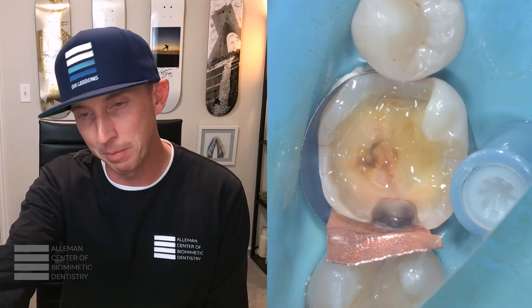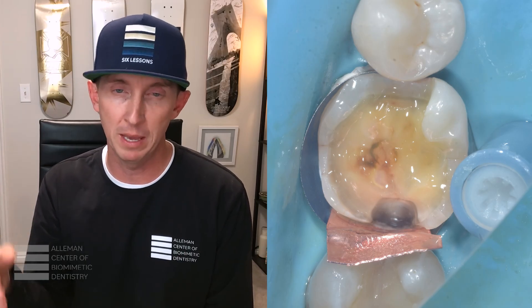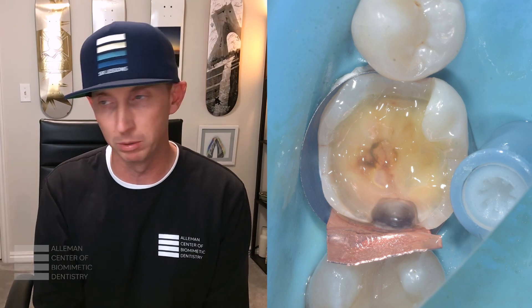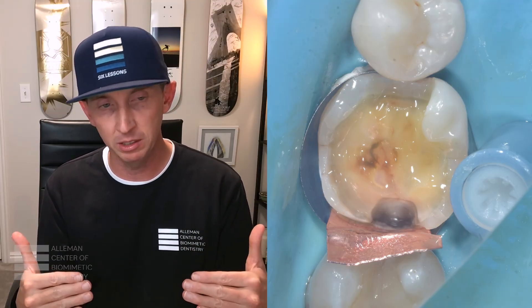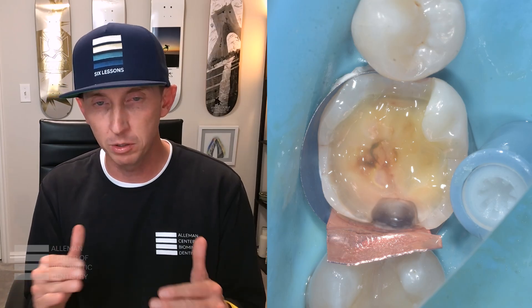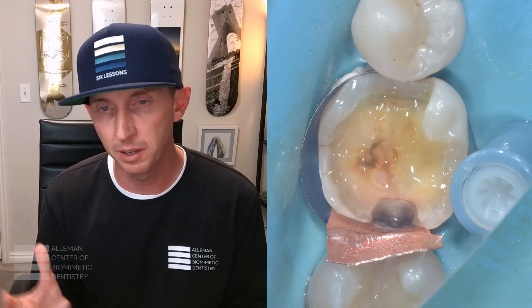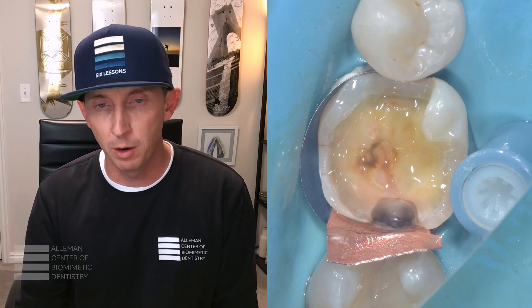As I was driving back from the big city to a smaller city, a lightbulb went on. I said, 'What if you tried just cutting the copper band and just pushing on it? See if that distorts less than a stainless steel band.' I haven't found a better material to push a band approaching crestal bone, because it's very resistant to apical pressure, but also very malleable to adapt to either a convexity or a concavity. In this case, it's the Garrison Real Tight deep margin elevation band — but it could be an auto-matrix or a modified Tofflemire. It's just stabilizing the copper.